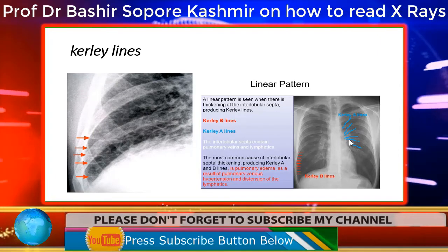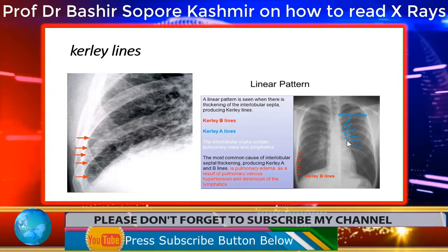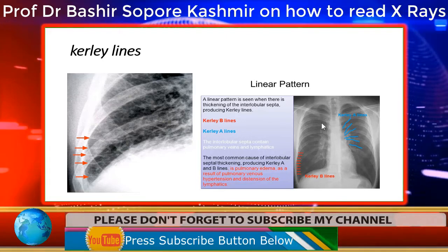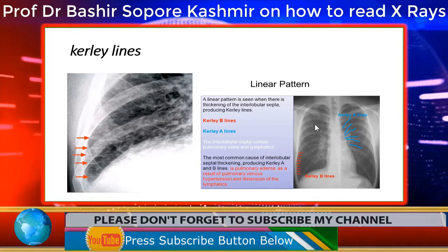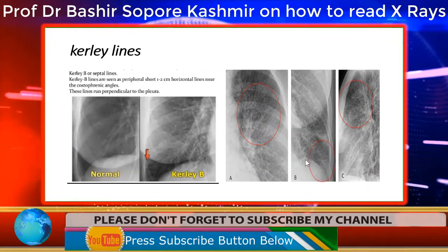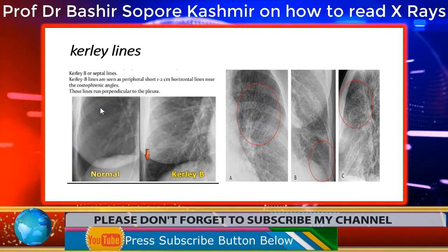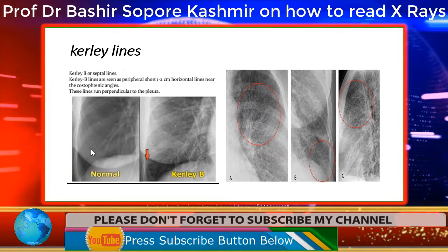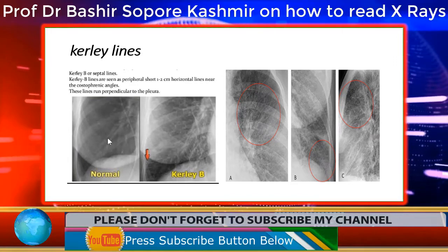While Kerley A lines run obliquely upwards like this. They are not horizontal, they are slightly oblique, mostly seen in these regions. So this is normal. We don't see any lines running obliquely upwards like this, right? Neither do we see any parallel horizontal lines like this. So this is normal vasculature, what you see here, the vascular markings.